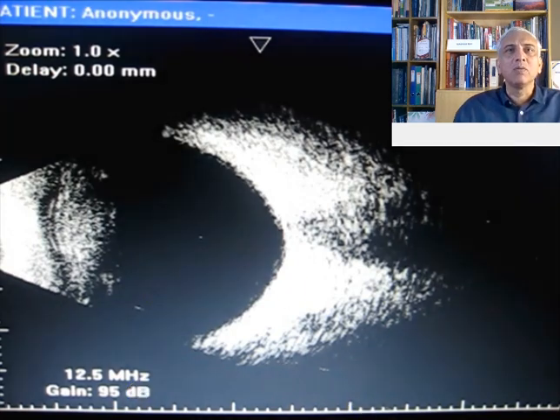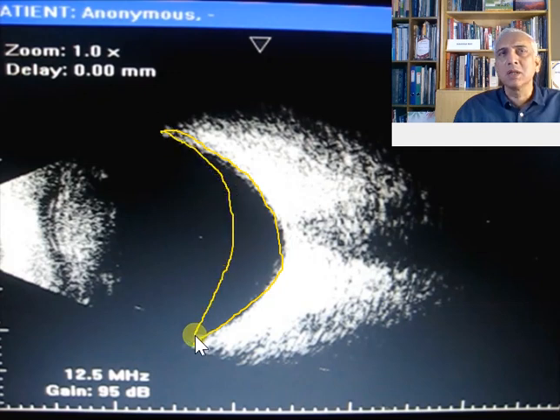And what you're seeing over here in this scan is the surface of the retina. This patient seems to be slightly oval compared to what you would see in a circular posterior curvature of the eyeball. And this type of longer, oval appearance would represent patients with high myopia. So this is the case.